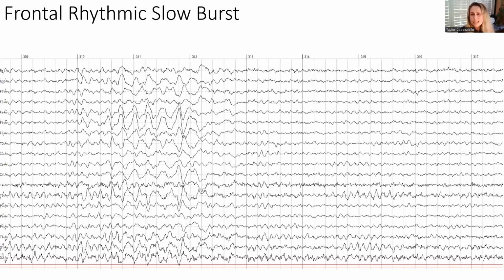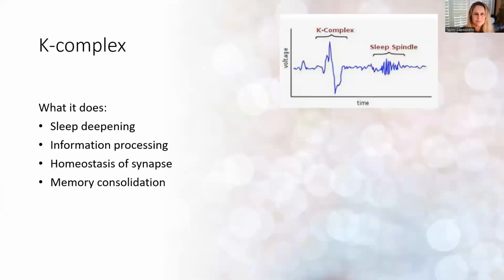more. So when you see this in a client, once again, we're not trying to fix this, but it's going to flag they probably have night terrors or sleep paralysis or something like that. So don't be alarmed sometimes, and usually you can talk to your client and they're going to be able to confirm this. And finally, like I said, with the K complex.